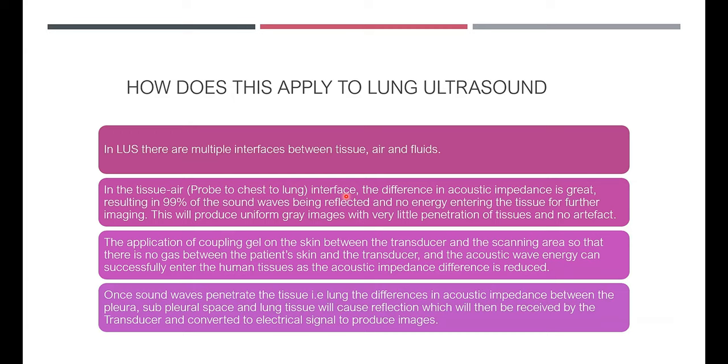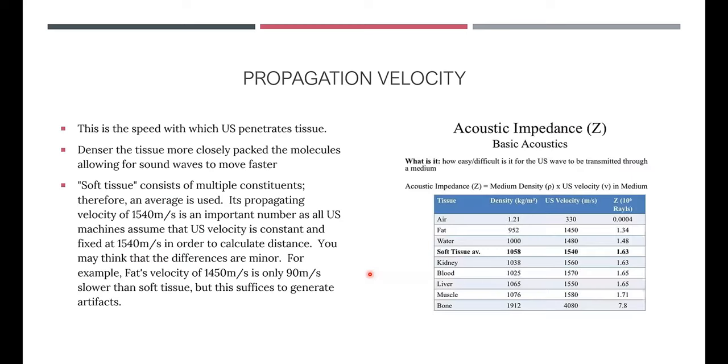And the reason for that is air has blocked the ability of the sound waves to propagate through it as a medium. On the other hand, if you apply gel to a surface, you improve the ability for sound waves to propagate through that area and are able to see the deeper structures. So these are all concepts that are linked to the concepts that we've just discussed.